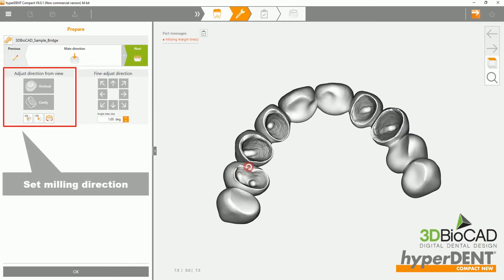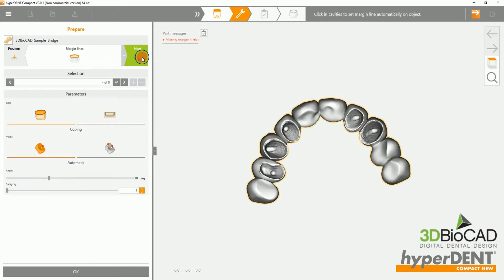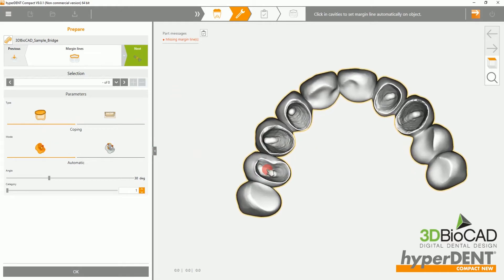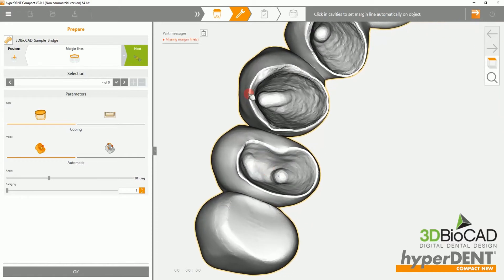Then you will be setting the margin lines. Please zoom in and click on the margin line. After clicking on the margin line, it will automatically set where the margin is supposed to be.